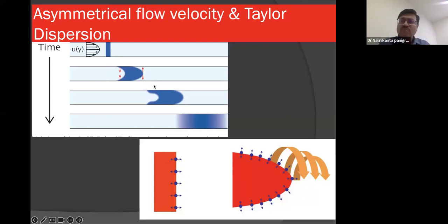So it reaches more area during inspiration without much pressure. And Taylor dispersion, the example of how it comes, you see the horizontal flow. When a bulk flow of gas goes, the molecules, how many levels are there? It's 5 molecules, for example, it disperses into the alveoli and bronchioles.